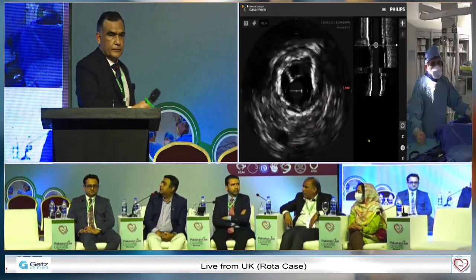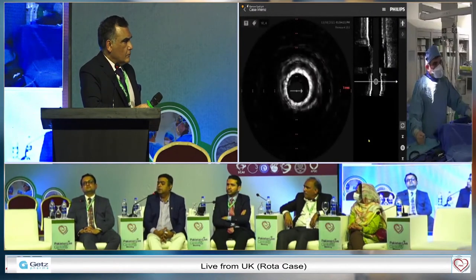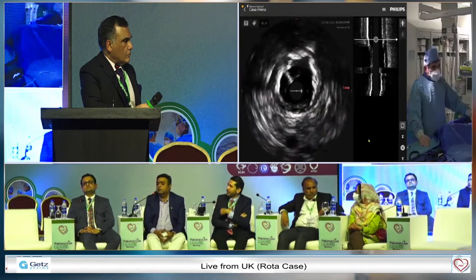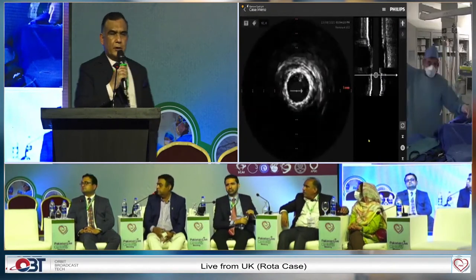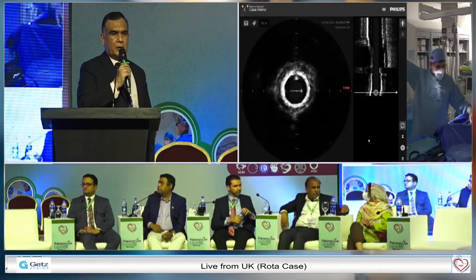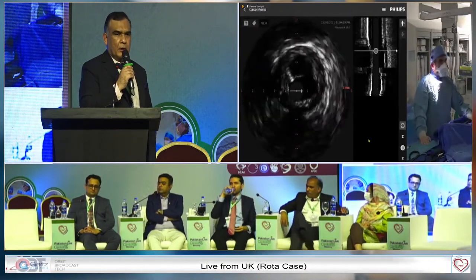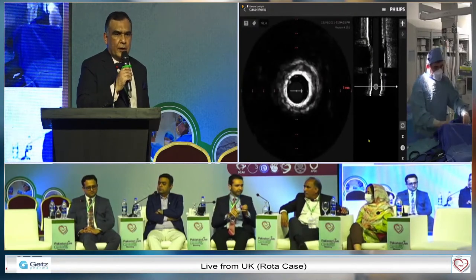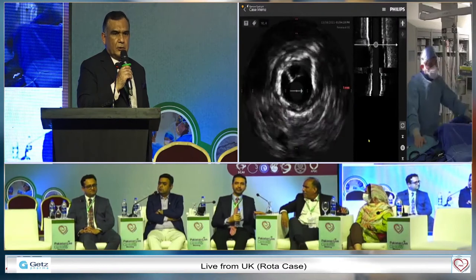Question, two points. The question is here, then what should be the limit? As this artery is about 3.5 or 4.0, whether we should go for 2 or 2.25? Monath, the question is very relevant and it is a mechanistic thing: if the artery is, let's say, 3.5 or 4, then what's the difference? You are still with a 2 burr, you are modifying it. You are not actually ablating the media, you are still modifying.